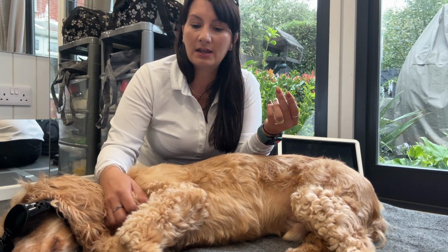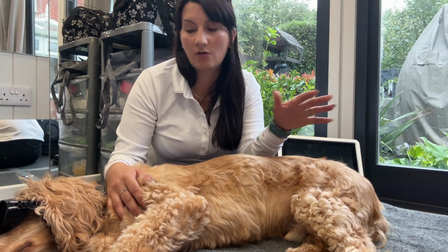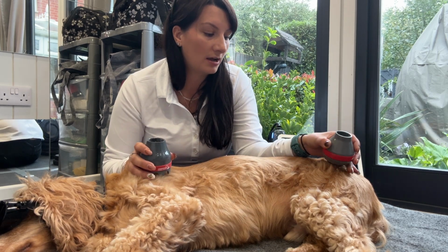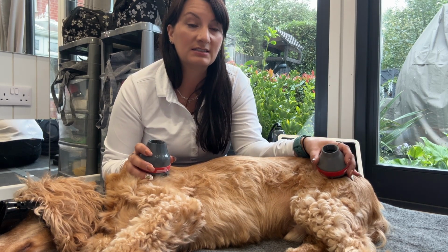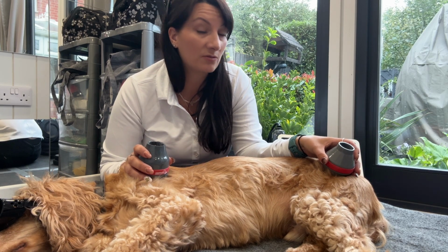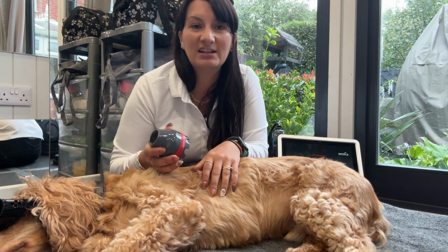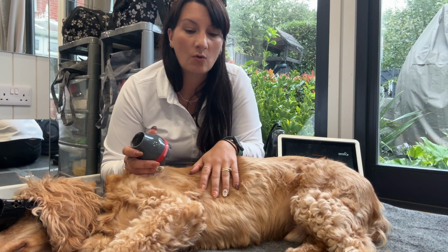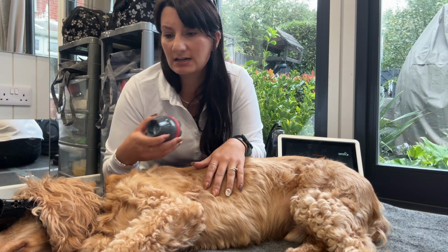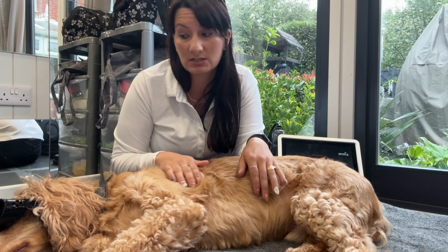The other thing to think about is how are we going to apply the laser? Are we in contact with the patient or off contact? We have different types of heads, so different lasers with different heads, so whether you're in contact and able to compress some of those tissues and some of that fluid out of the way, so we're getting more light into deep tissue, or do we have a patient that actually just does not like being handled, or there's an infectious reason where we don't want to be touching? Are we off contact? Because again, that's going to make a difference of how much light is going to be absorbed by your target tissue as well.